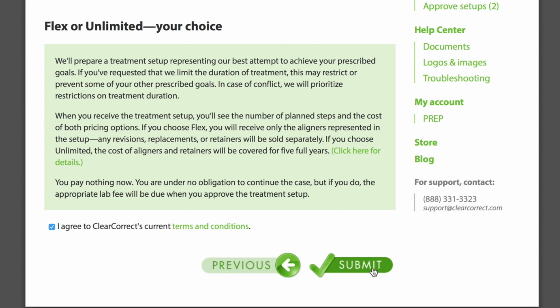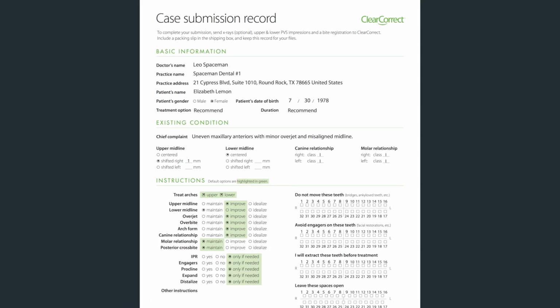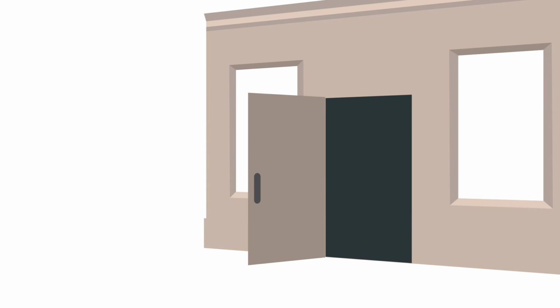After you click Submit, you can print a submission record. This is for your files. Don't submit this to ClearCorrect. If you're using PVS impressions, you'll also need to print a packing slip. Cut the slip in half and put half of it in the box with your impressions. You can use any sturdy shipping box, including the ones we use to send you aligners. Tape the shipping label to the outside of the box and drop it off at your nearest shipping location.